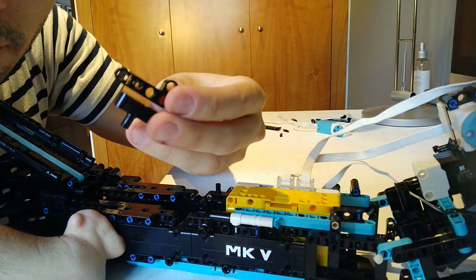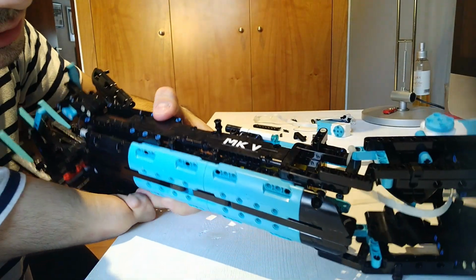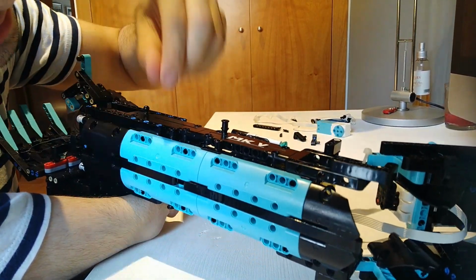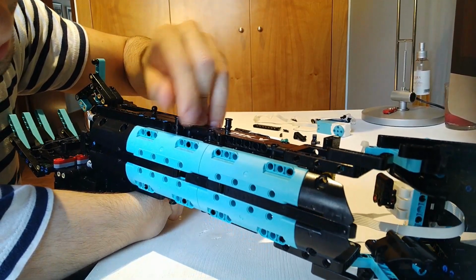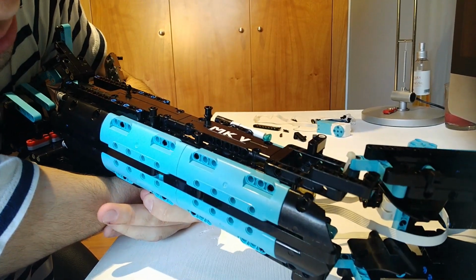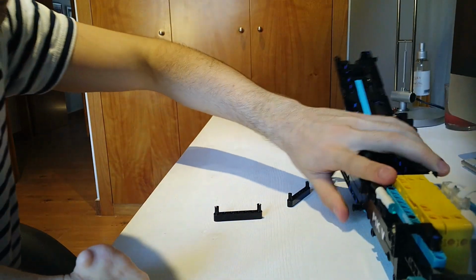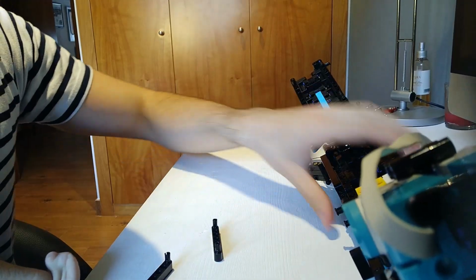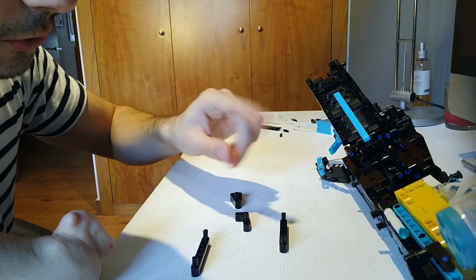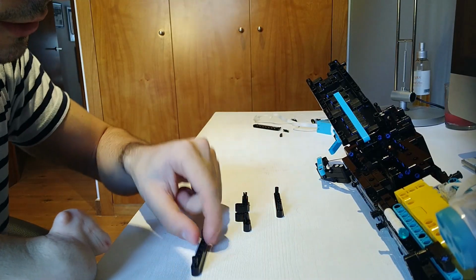The bricks that should fall off are these ones. Now we go to the bottom part and we see another pin that's connected on both sides, so we remove them as well. Just halfway. So we have these two bricks that fall off. Okay, so once you remove those pins, you actually have these bricks right here.